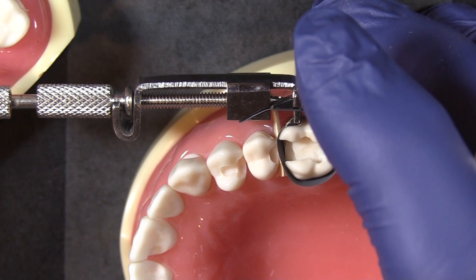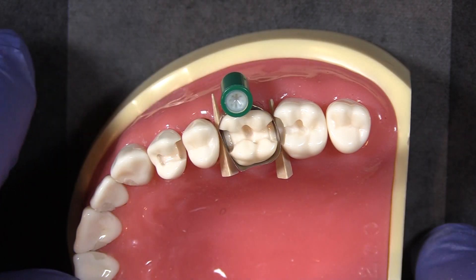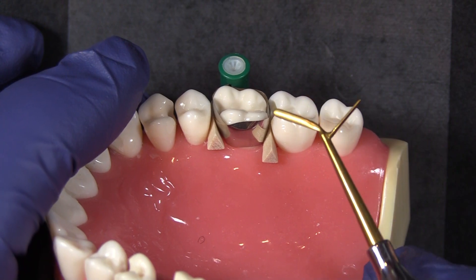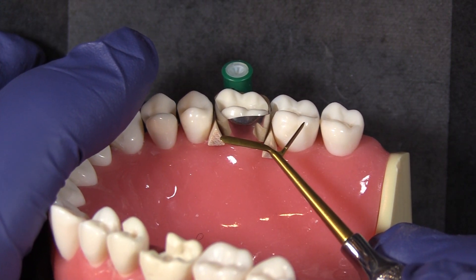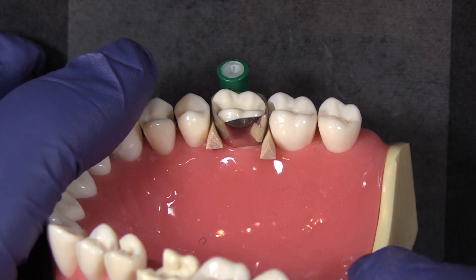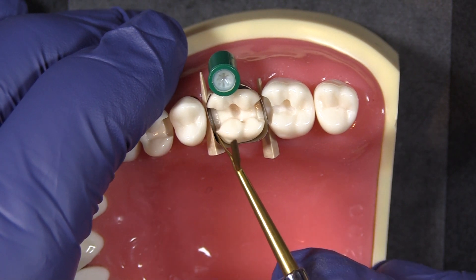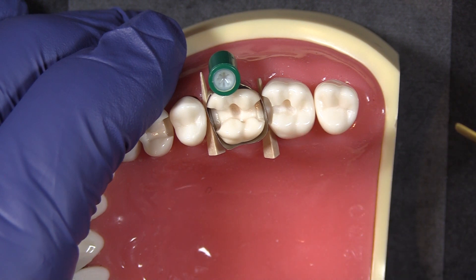Now let's look at a retainer-less system. The benefit of course is you don't have that large retainer hanging out of the patient's mouth, but you still have all the other issues. In order to get separation we need to wedge very aggressively and we start creating food traps and point contacts. In order to burnish the bands against the adjacent teeth, I have to loosen the band up, and when I do that I open up the buccal and lingual margins for flash.